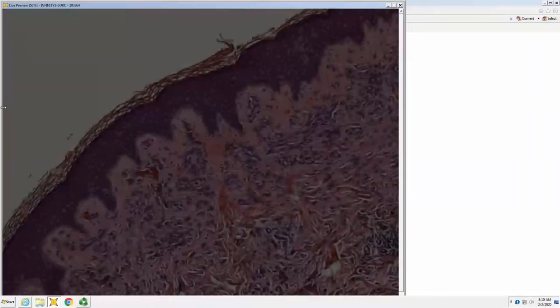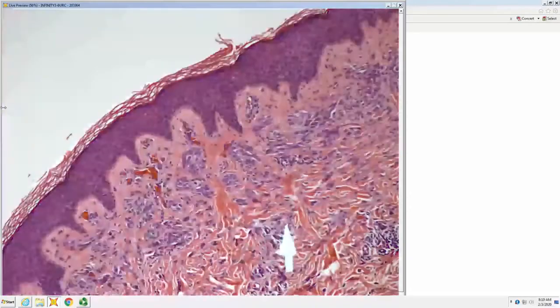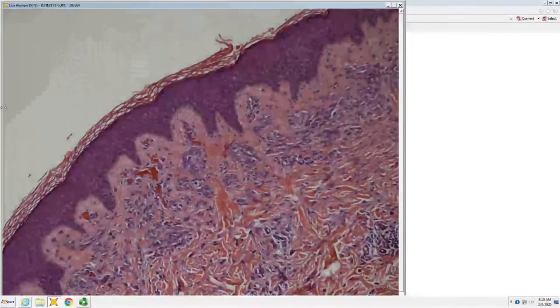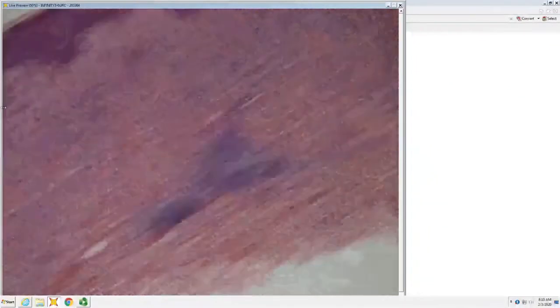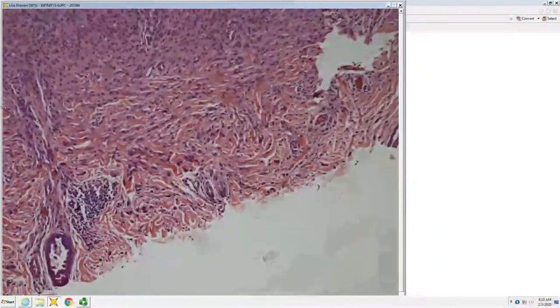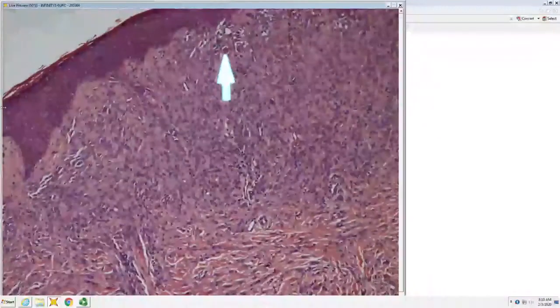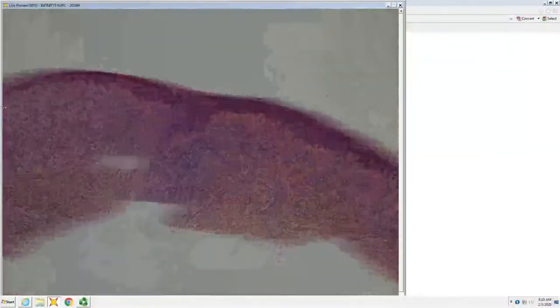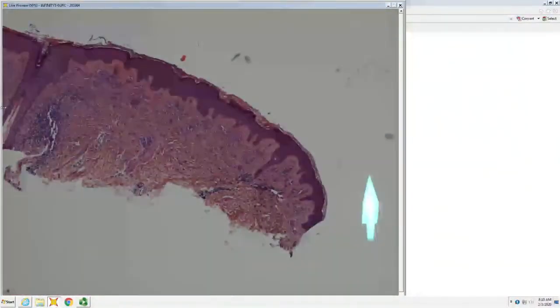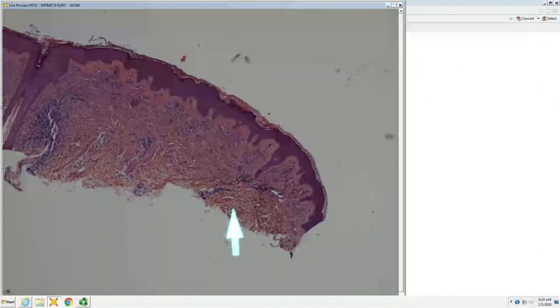It's melanocytic. Larger spindle than epithelioid cells. Let's say more like a Spitz. It has a little bit of a junctional component. It's mainly dermal. It does disperse in the deep layers. And then you also look at the collagen. It's small and very red, so it does look like child skin.